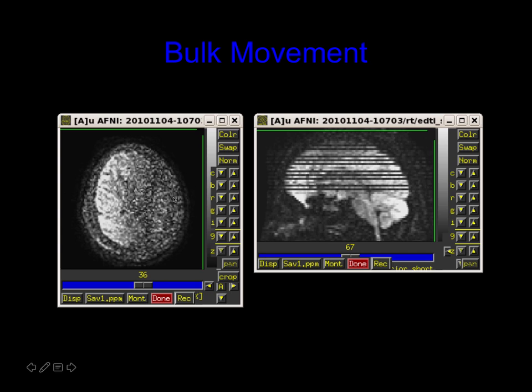So here's one where you have about half the slice as noise, and if I take all of these axial slices and resample them into the sagittal plane, you can see that I've got multiple slices of dropout. So clearly you would not want to use this volume in your calculation, because the signal loss here is not due to diffusion, it's due to this greater bulk motion. So we just have to throw these whole volumes away when you do your calculation.